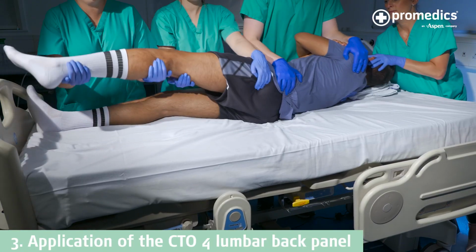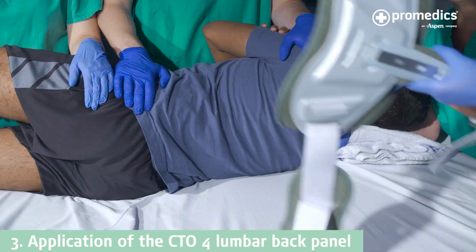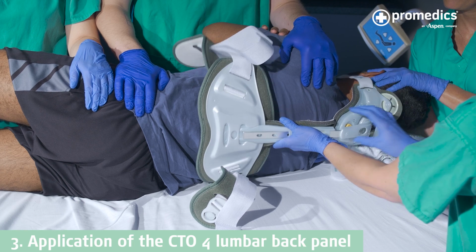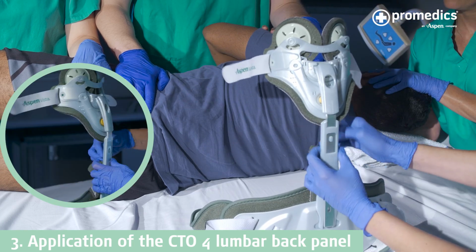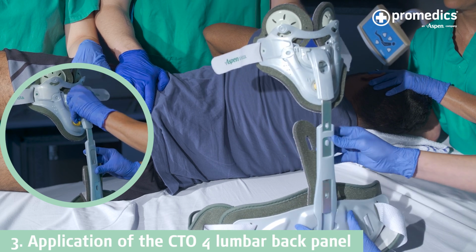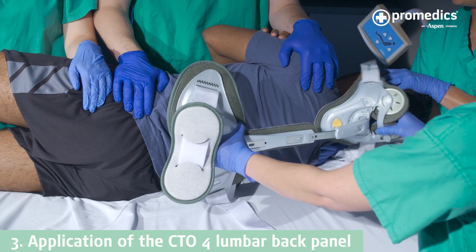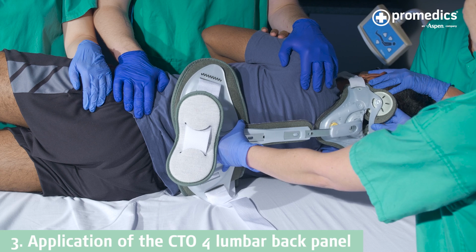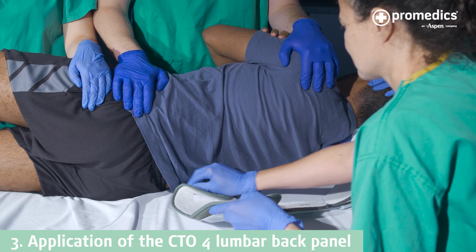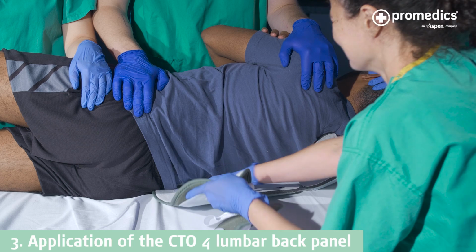If fitting a CTO4, a 4-person log roll should be performed. Line up the back of the collar so the straps are mid-neckline, and then assess if the posterior strut will need to be adjusted in length so that the lumbar back panel aligns with the lumbar spine. Once the sizing has been adjusted, slide the lumbar back panel under the patient and position so that the posterior strut aligns centrally, checking all pads are in place.